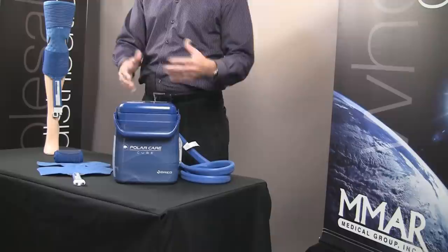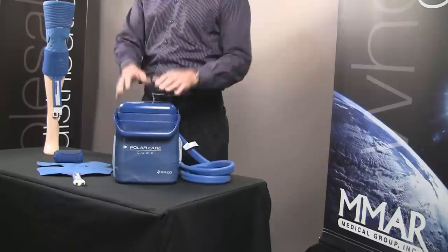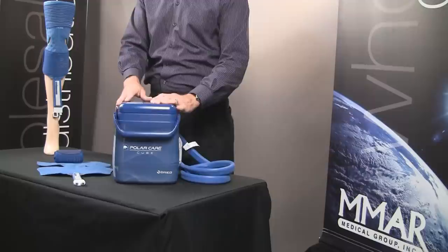By allowing the cold to circulate through the pad for an extended period of time, it allows that cold to penetrate deep into the joint space, cooling down that joint space which reduces inflammation. It also reduces muscle spasms and therefore reduces the pain the patient might be experiencing.